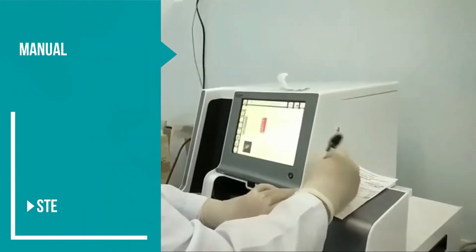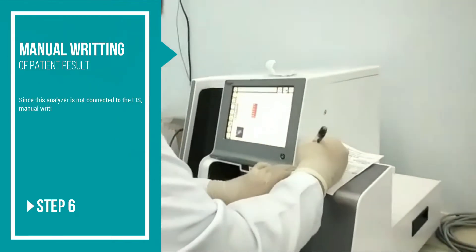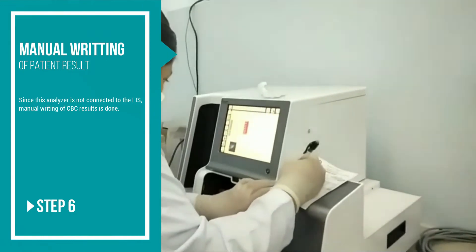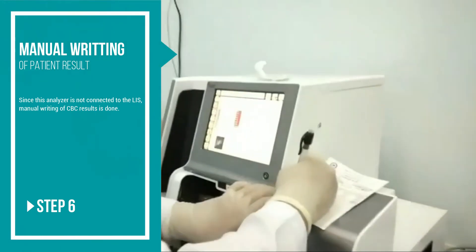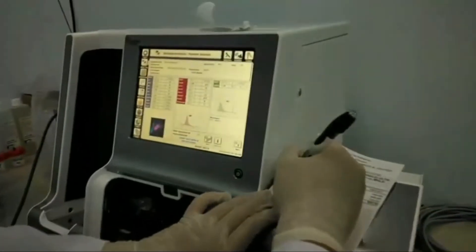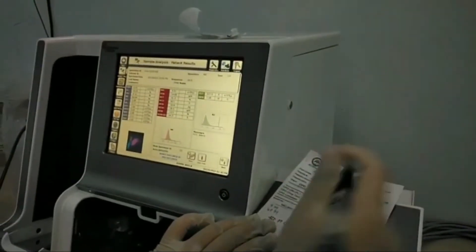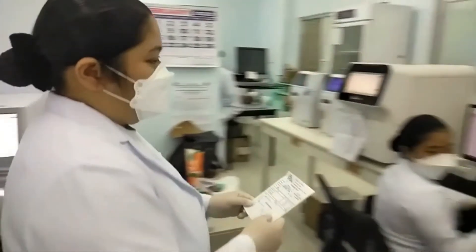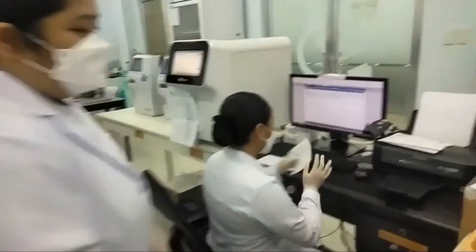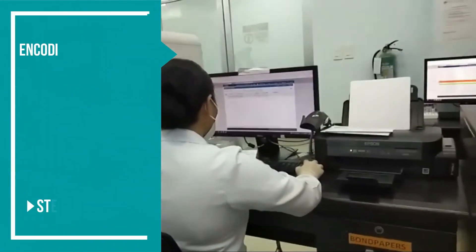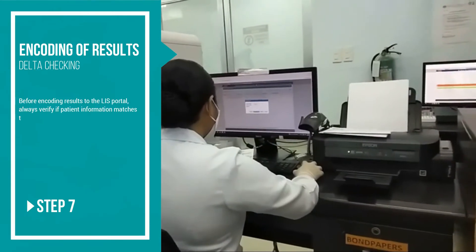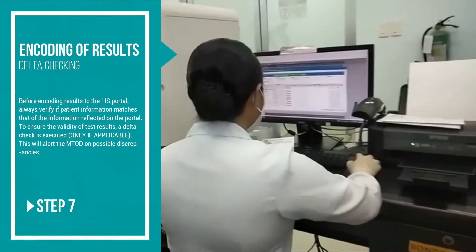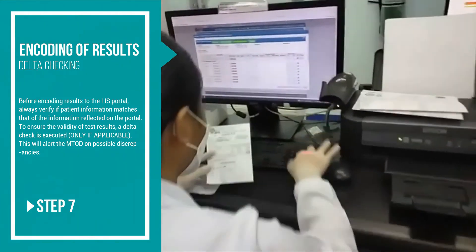A couple of minutes is enough for the analyzer to release the result. Since this analyzer is not connected to the laboratory information system, manual writing of CBC test results is done. Before encoding results to the laboratory information system portal, always verify that patient information matches the information reflected on the portal.